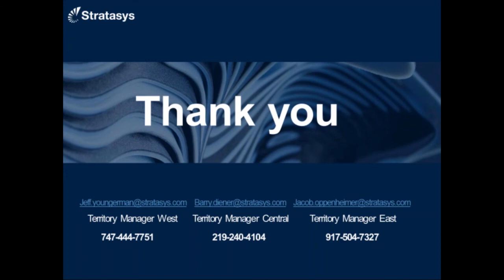Okay, cool. And then what kind of digital impression systems, you talked a lot about that, but which digital impression systems will the printer work with? So most of the impression systems that are on the market today will generate that STL file. So from that standpoint, I would say all of them. The only one that's a little bit unique, and Cody actually showed it within his presentation, would be the Sirona scanner, which just simply needs to go through the in-lab software, which is their proprietary software, and then it can be exported out through an open model license that's available, and then you can print it as well. So as long as we have all those components in place, any STL file, any impression system will be able to work with our printer.